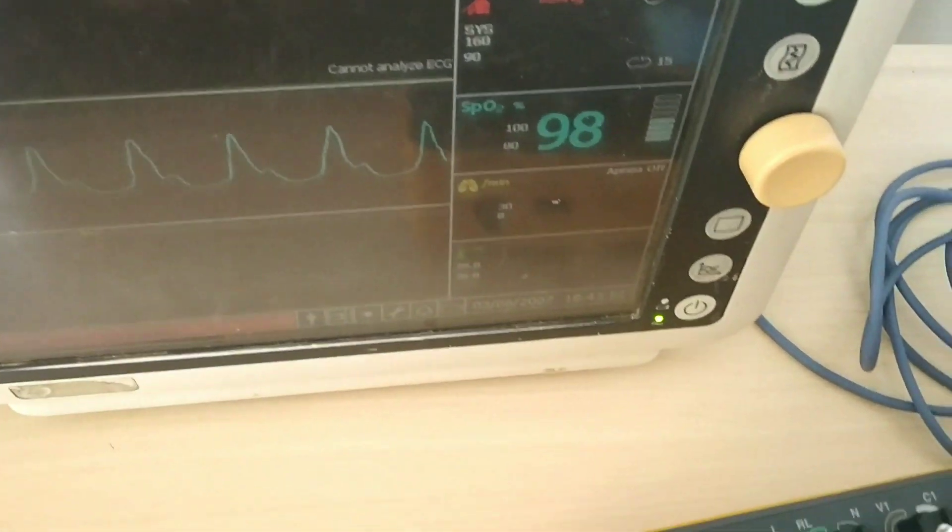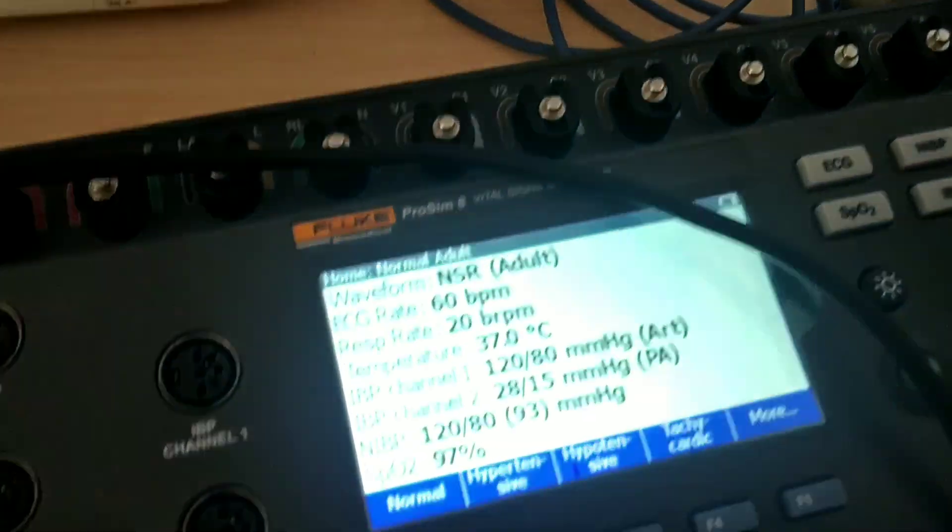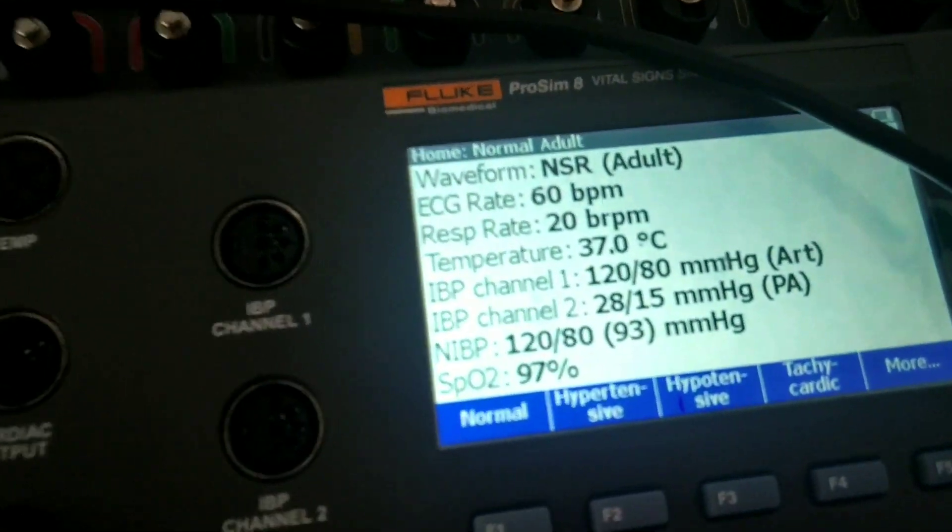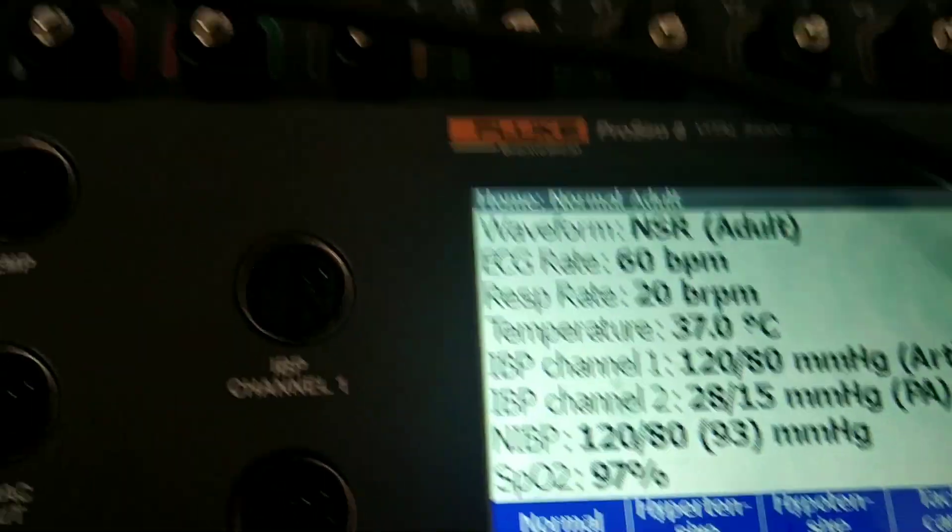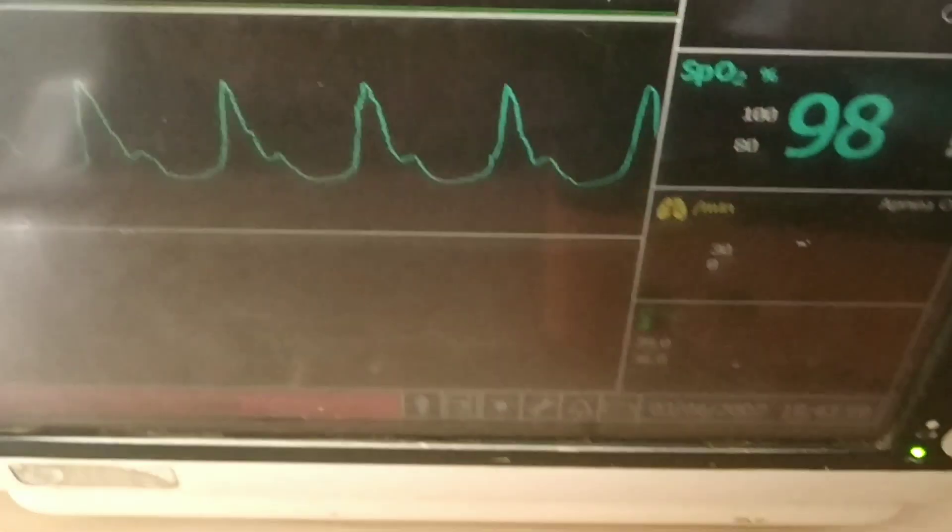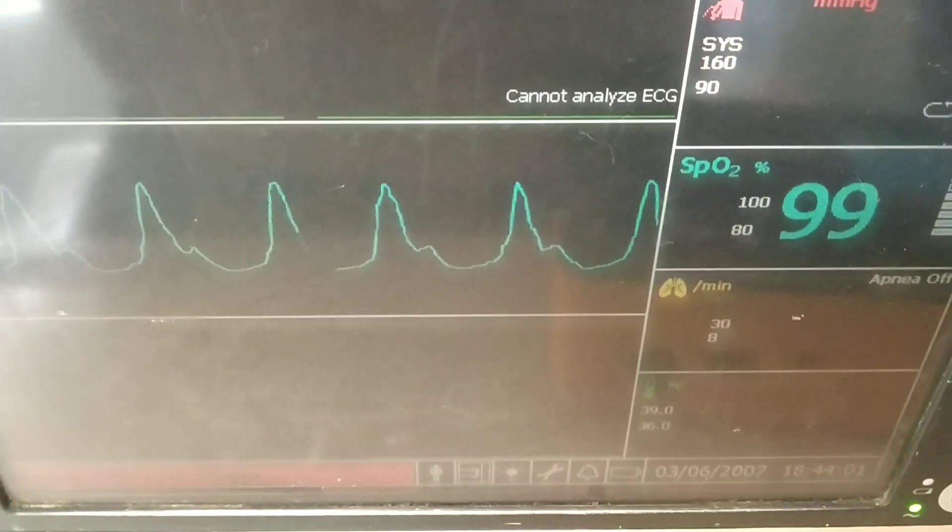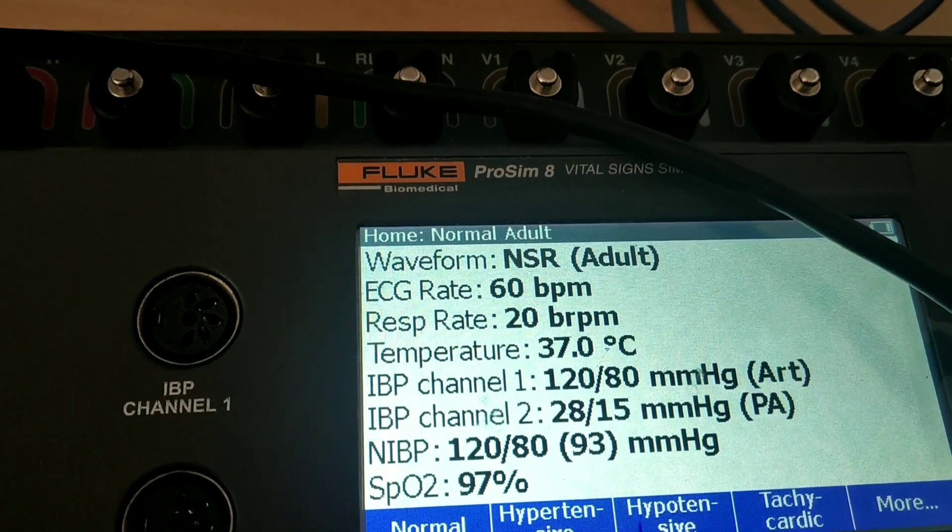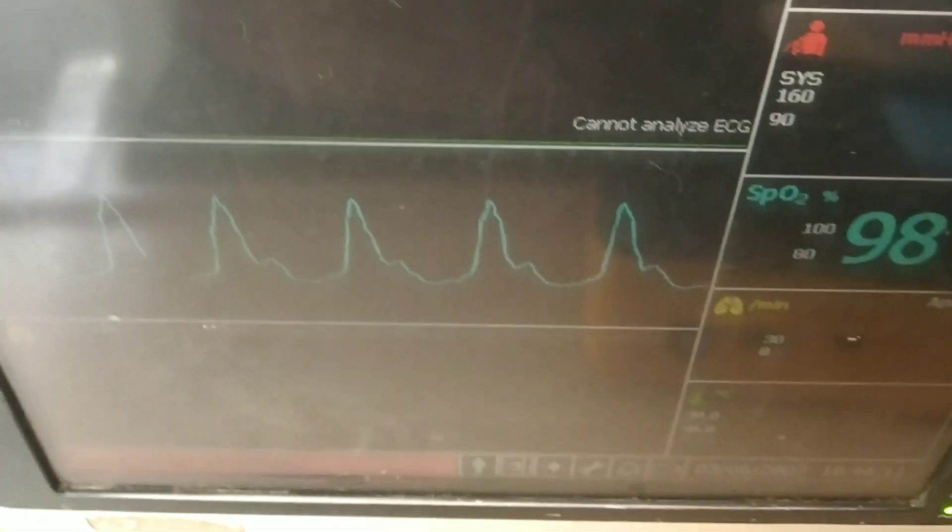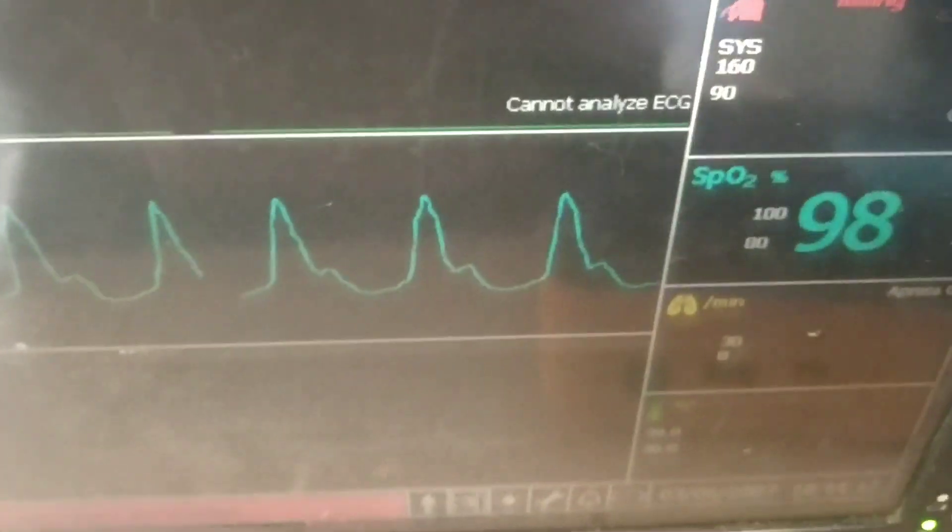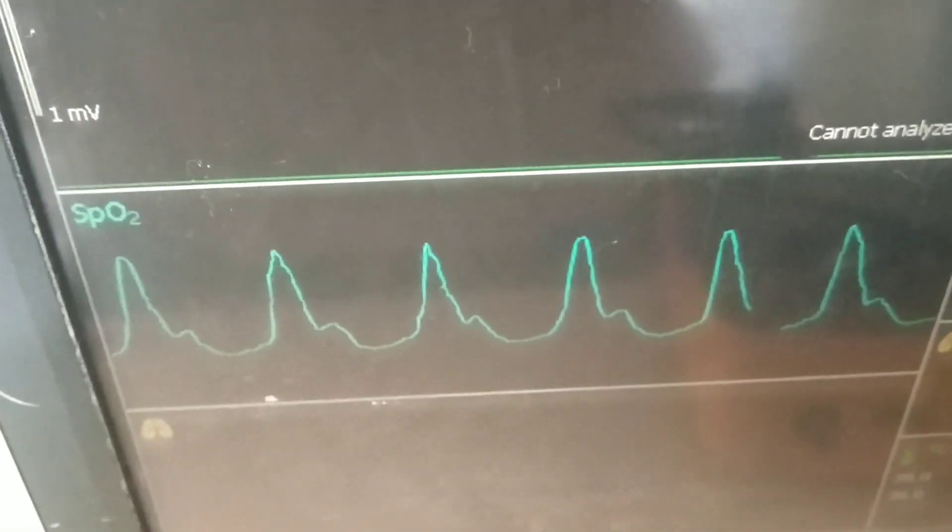We will be doing the same setup two or three times and then we will check the readings. Then we find out the error percentage.